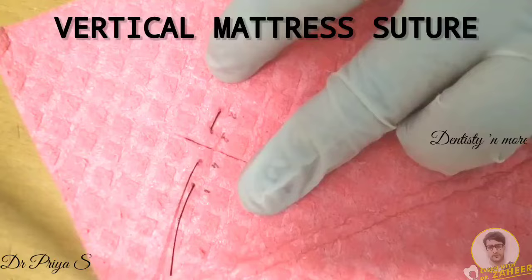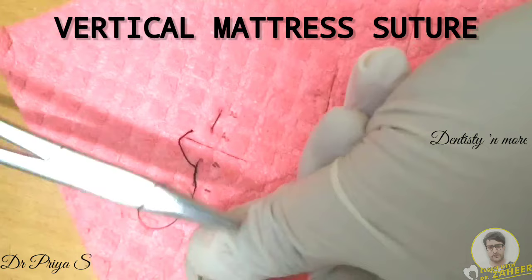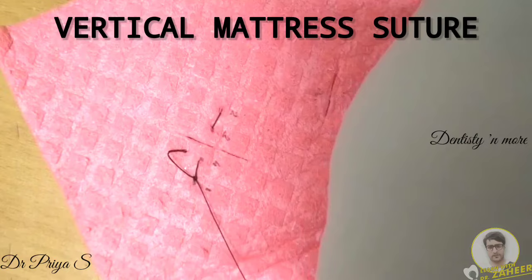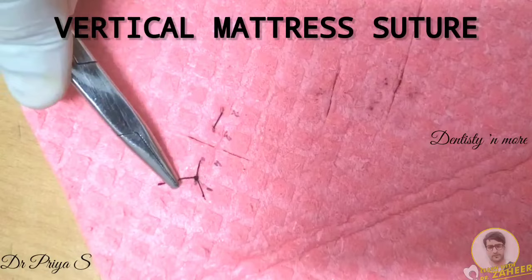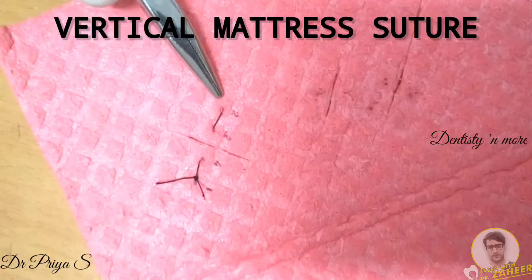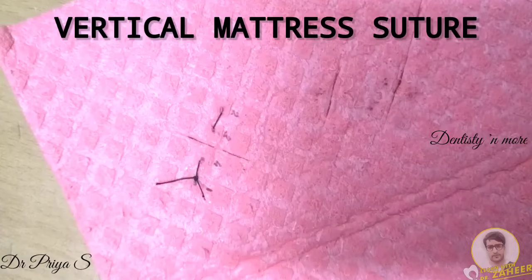You then tie a surgeon's knot. It is the two superficial bites near the dermal edge that help in close approximation of the wound edge. The first two bites — points 1 and 2 — are deeper and farther from the wound edge. The third and fourth bites are superficial and nearer to the wound edge. The advantage of vertical mattress suture is that it helps in reducing dead space, provides greater strength across the wound, and doesn't interfere with healing as the suture runs parallel to the blood supply.